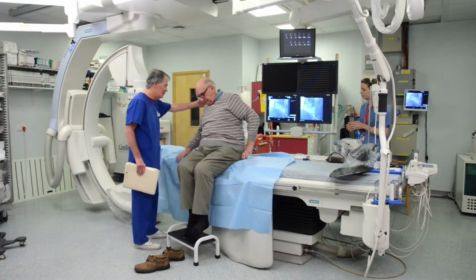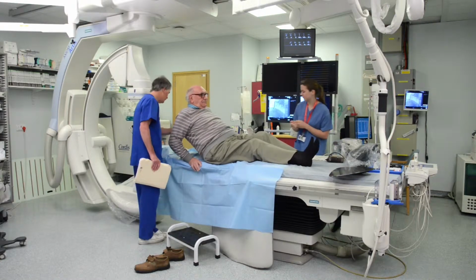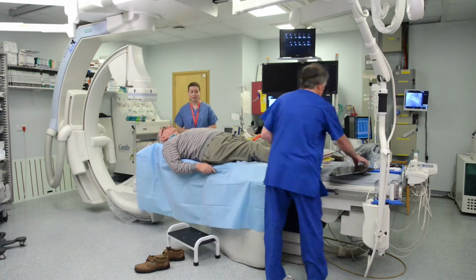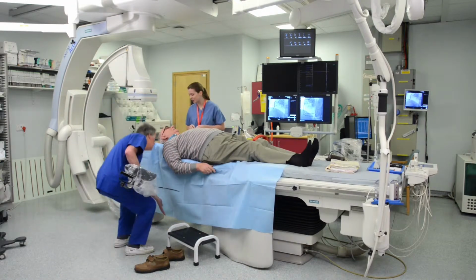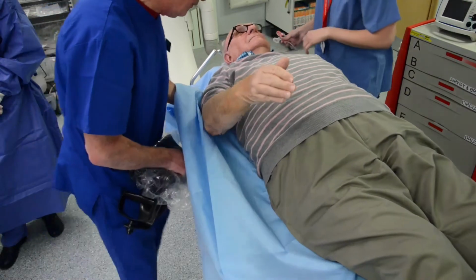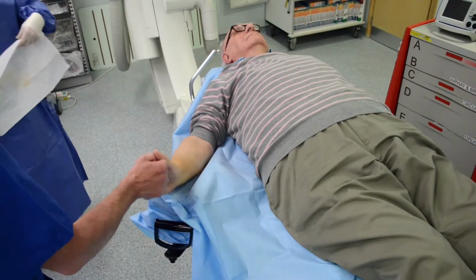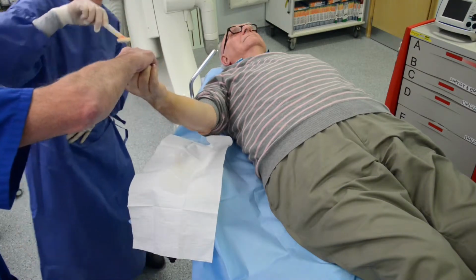In the lab, you will be asked to lie on an X-ray table. A cardiac physiologist will attach you to a set of leads on your chest, arms and legs, which will record your ECG and pulse. Your blood pressure will also be recorded. If your procedure is from your wrist, your right arm will be placed on an arm board. A nurse will clean the area of incision, which could be your wrist or groin.